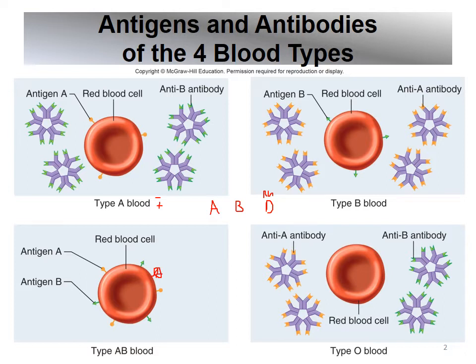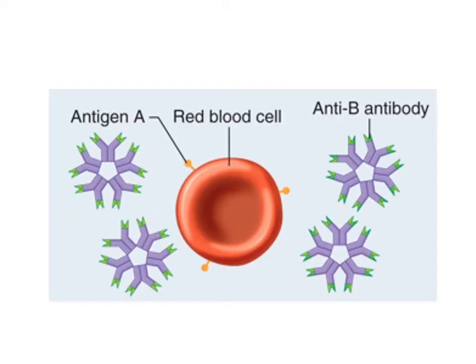Again, just giving you examples. So again, the big thing is just understand there's only 3 possible antigens, even if I include the Rh factor in everything. Only 3. So all blood types are a combination of these 3. So with that being said, we'll look at the blood types and how this would work.